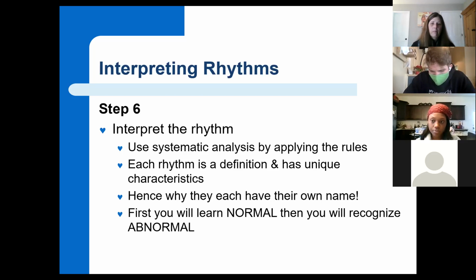Okay? All right. So go through the 6 steps. First, you're going to learn normal, and then you're going to be able to recognize the abnormal. Okay?